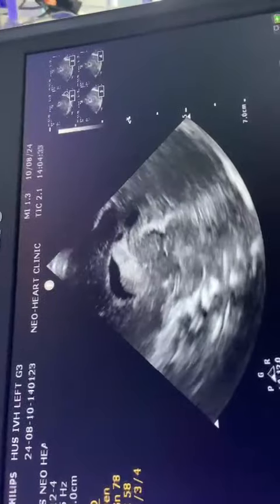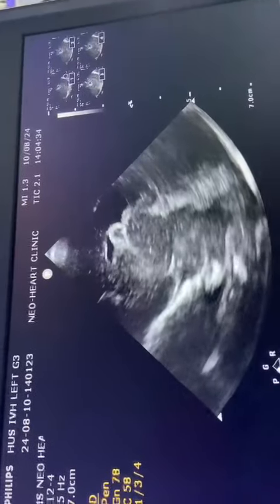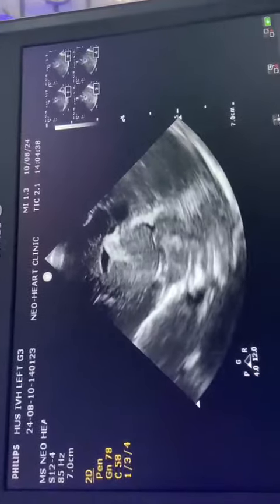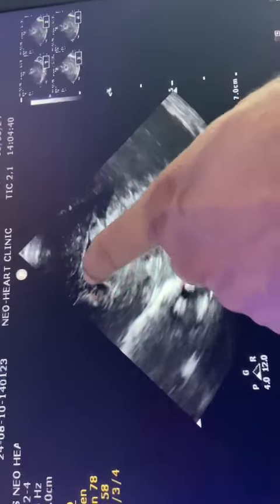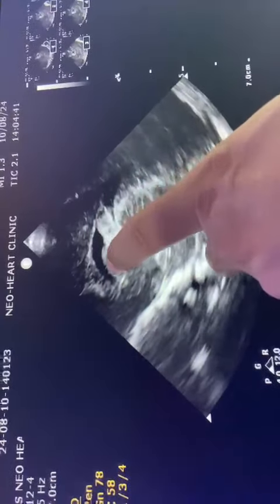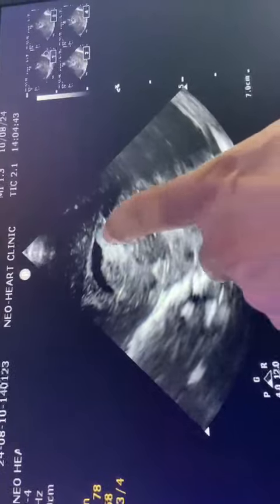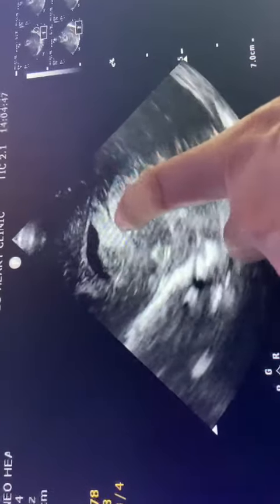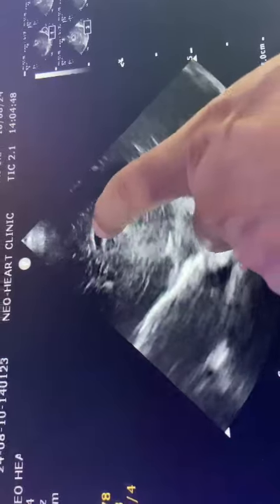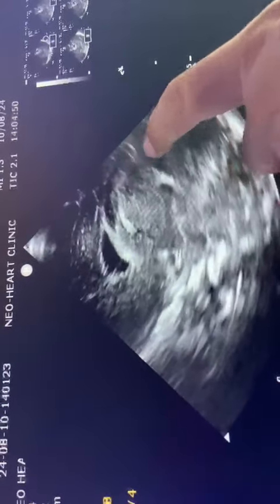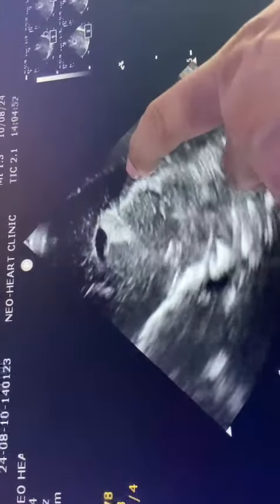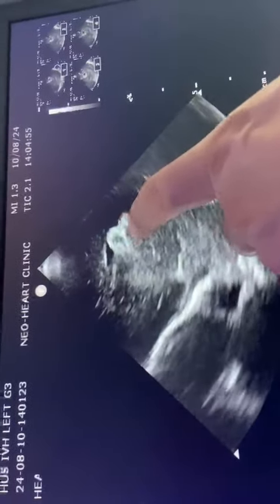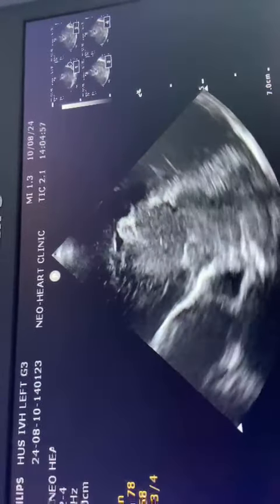Then we see it on the parasagittal view — this is mid-sagittal and this is parasagittal. Here you see the caudate nucleus and thalamus in the caudothalamic groove. This is where you see the germinal matrix bleed, but when it extends beyond that, covering less than 50% of the ventricle, this is Grade 2 — so this is left side Grade 2 bleed.